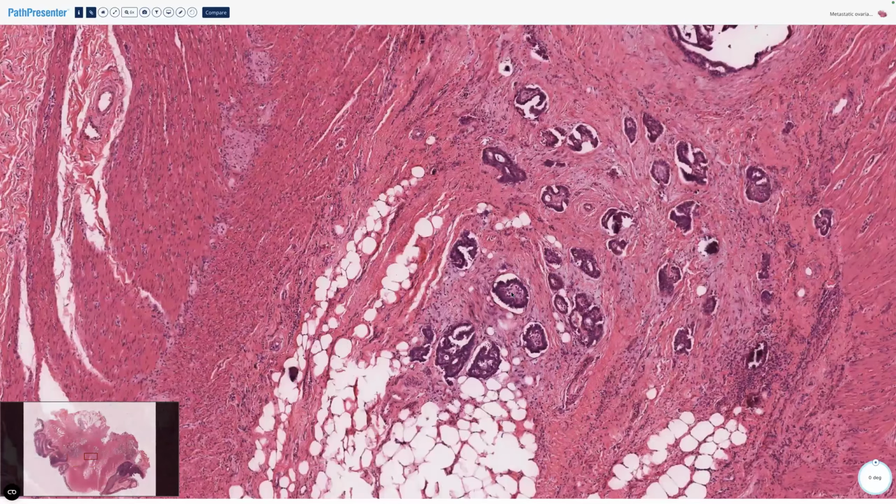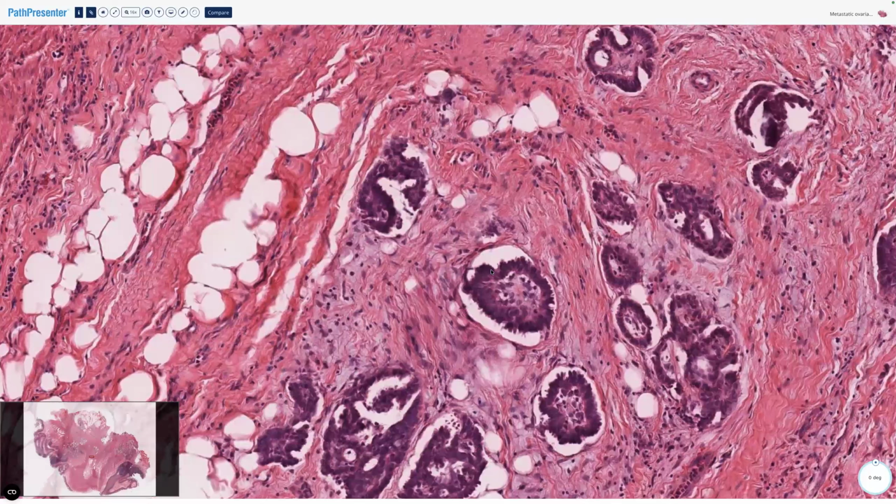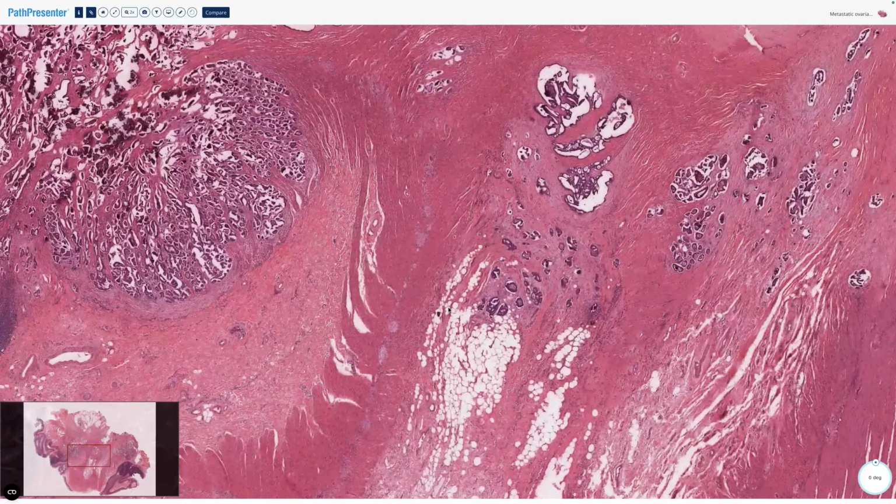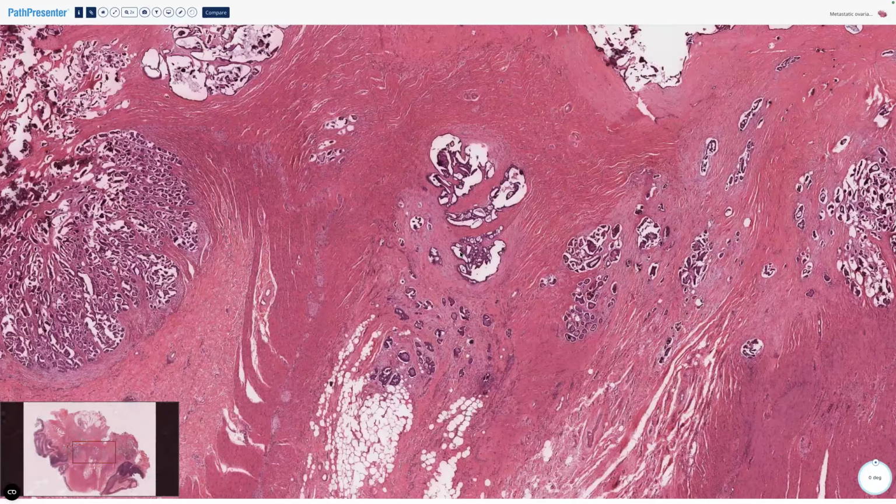Oh, these are all micropapillary. You can see the little hairs of the micropapillary coming out there. Maybe there isn't any other pattern. All right. Oh, it's maybe forming some acini around here.